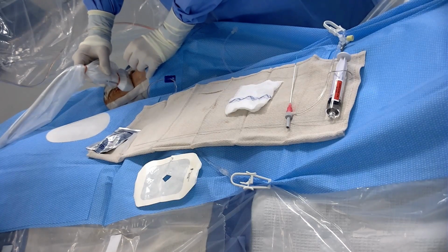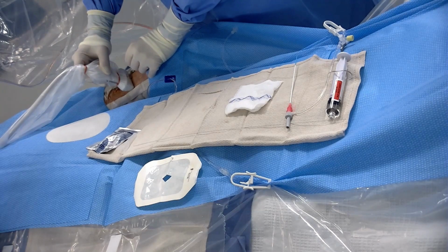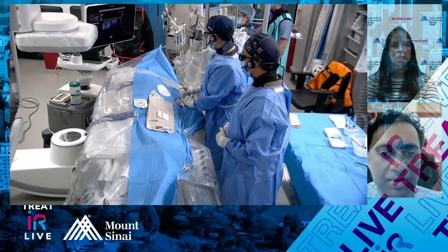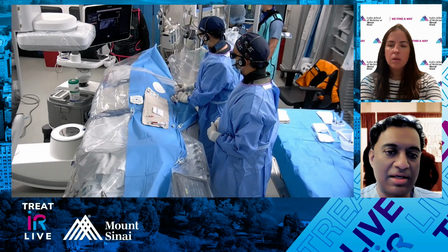So Goegy, his case is a little interesting, in that we see this degeneration of the right distal extension, but the one thing we don't see is a really big obvious leak. His sac is growing slowly over time. We've done an angio before, we didn't see a leak. I think that's not uncommon, unfortunately, with these kind of type 1s. People think they're type 2s, but they're really type 1s. They're just kind of occult.